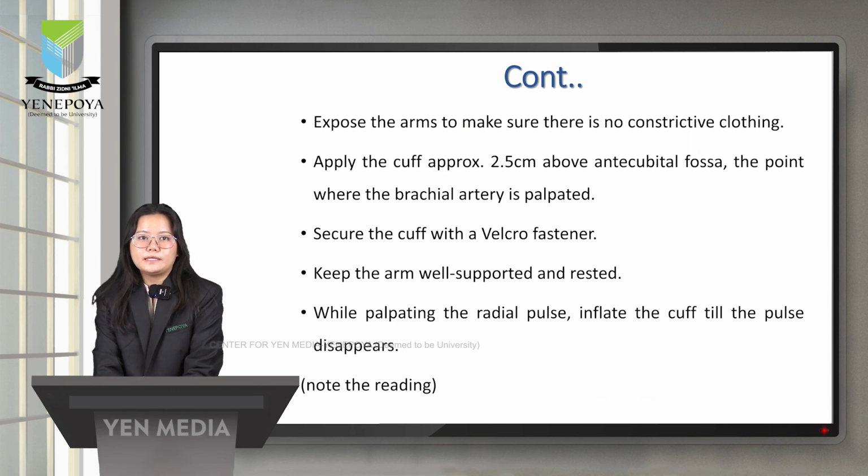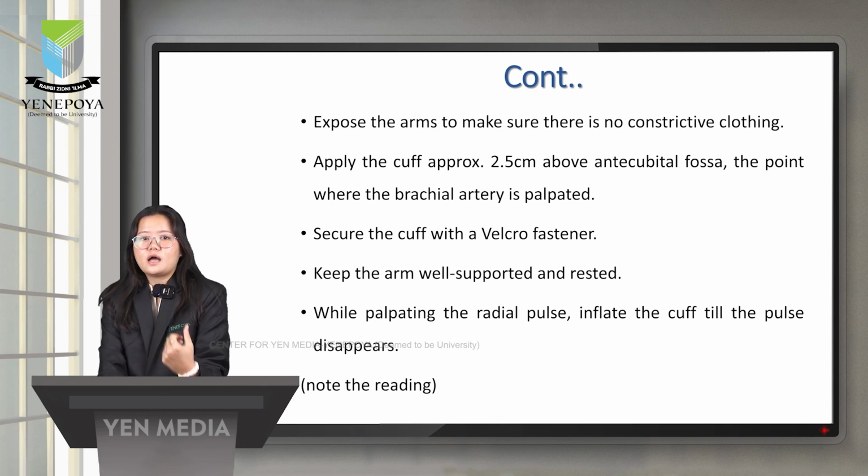Then we have to apply the cuff approximately 2.5 or 2 cm above the antecubital fossa. It is a point where the brachial artery is palpated. Now after the application, we have to secure the cuff by Velcro fastening. Then the arm has to be well supported and rested.